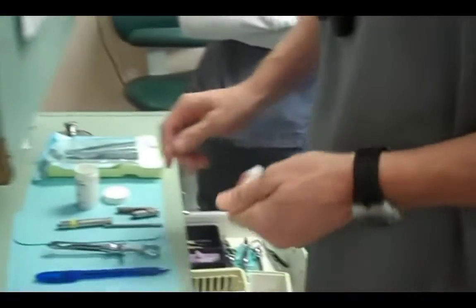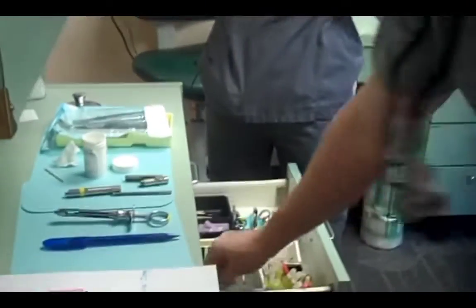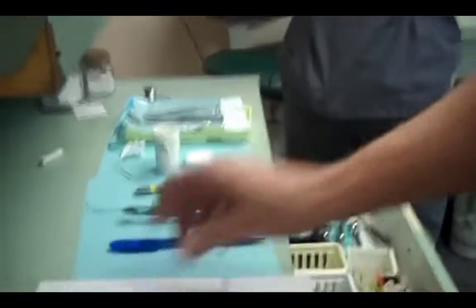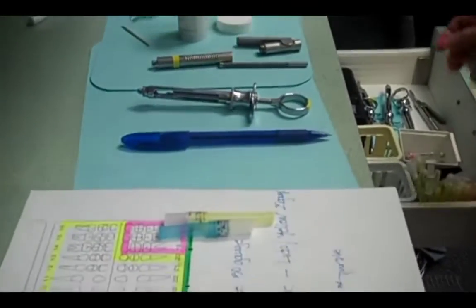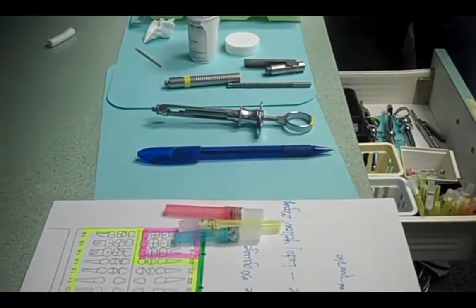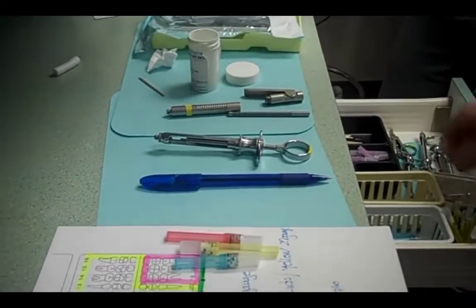All right. Sometimes it's confusing, the different types of needles we use and the different types of anesthetics we use. So I'm going to try to make this as simple as I possibly can to talk about the different anesthetics in the practice and why they're used. So let's look in the drawer here, and we're going to pull out the different ones.